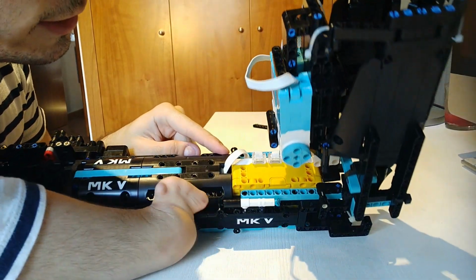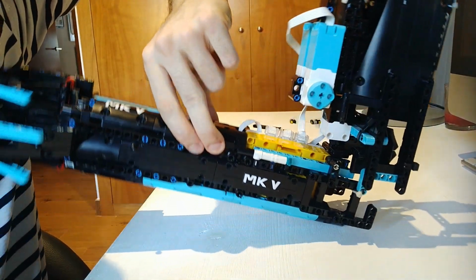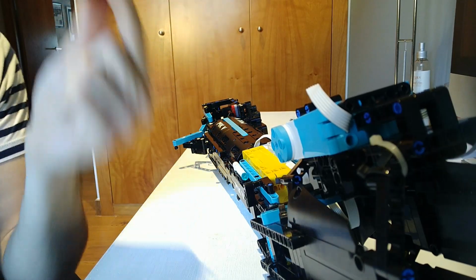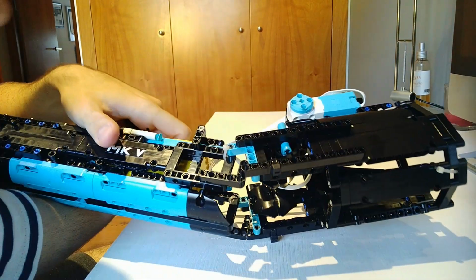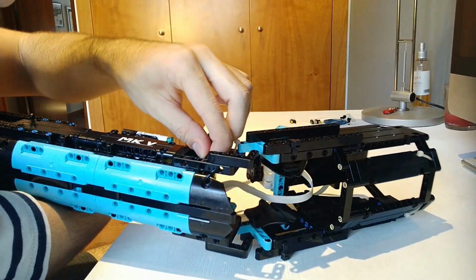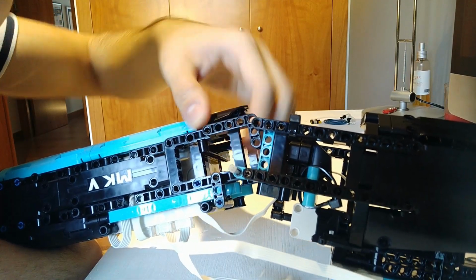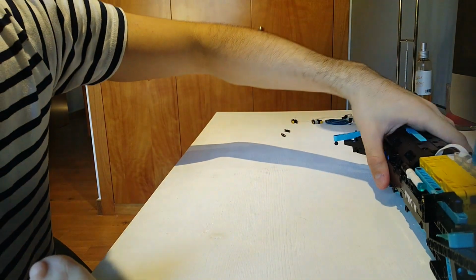So now the hub is connected. The top part is completely fixed. You can't remove it. You can actually hold the prosthetic by here so it doesn't fall. And now the only steps that are missing are connecting this lift arm. It's actually a 1x9 lift arm with 2 pins on the edges. And you're going to connect this square right here to the lift arm. It should look like this. And it goes all the way inside till the other side, and you can actually fix it. The last part is how to connect these motors to the prosthetic. And I'm going to show you.